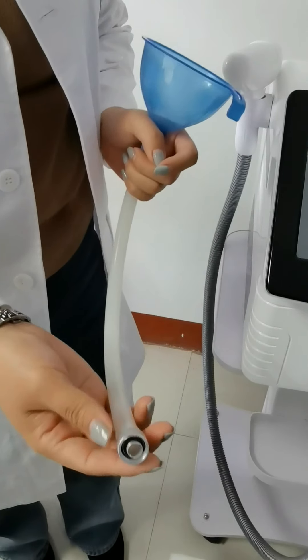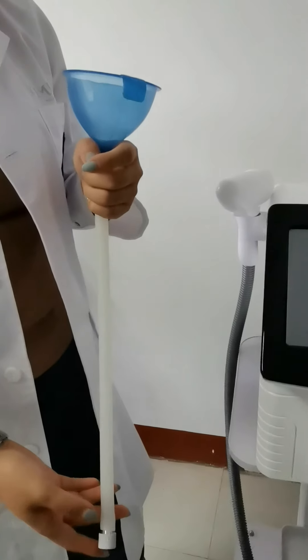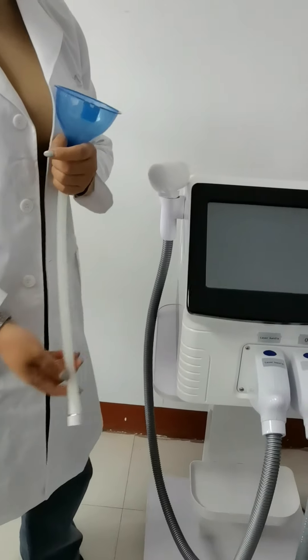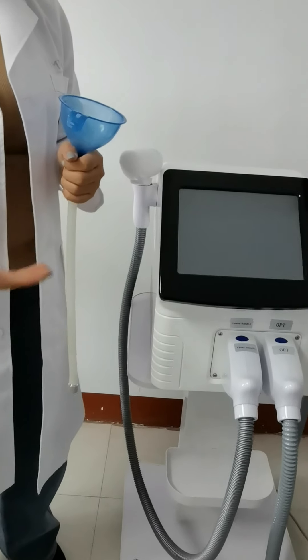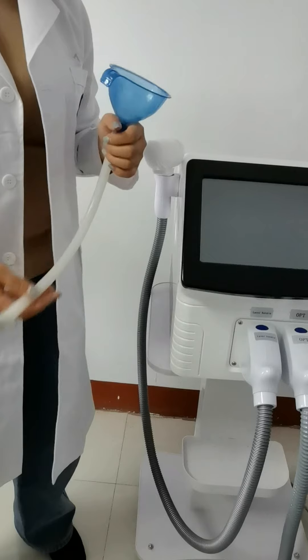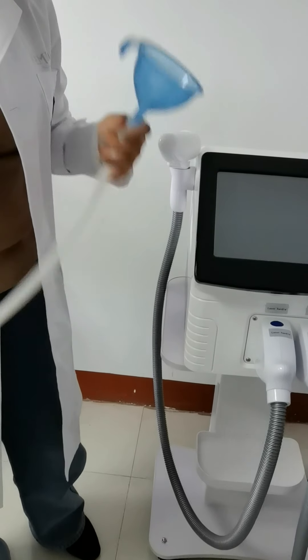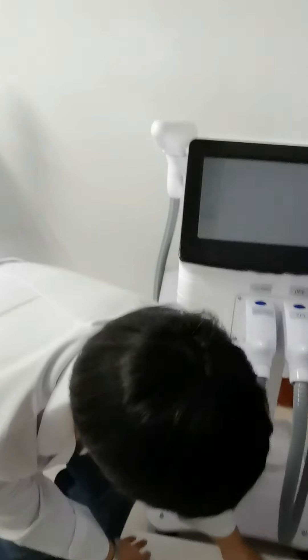The third step: you need to add water into this machine. You need to connect the water funnel — connect it with the water inlet part, and keep adding about five liters of pure water into this machine until there is water coming from the gas outlet vent. That shows the water tank is full and you can stop adding water. Do not forget to connect the set with the water inlet. This is the third step.